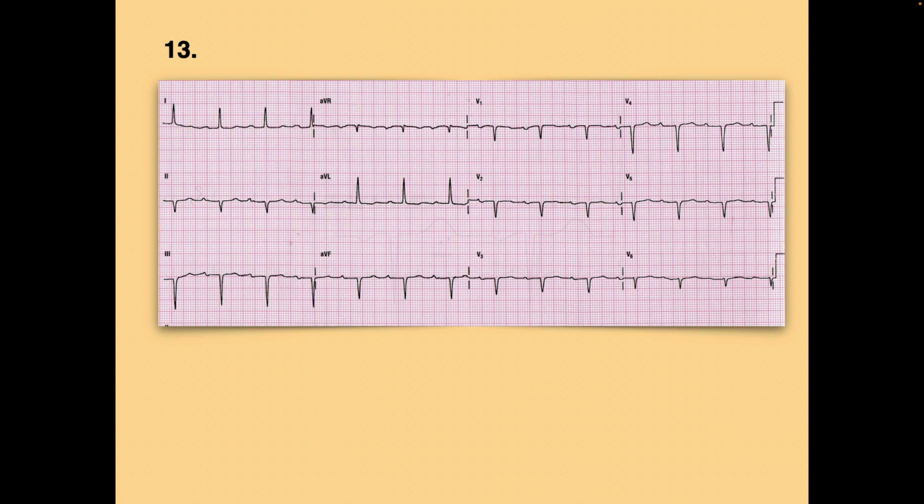It's the term that's used, meaning everything affects them. Seeing a flipped T wave, with a few exceptions, is not actually that useful for us because it can mean all kinds of different things. It makes sense to me that the repolarization would be going in the opposite direction, but I'm not entirely sure. Thank you.